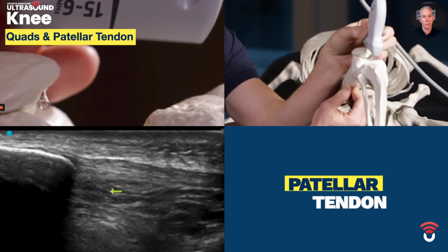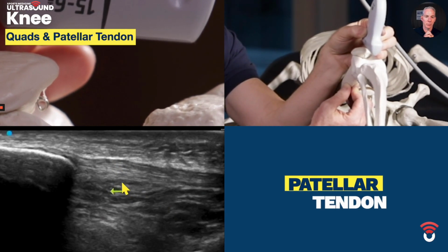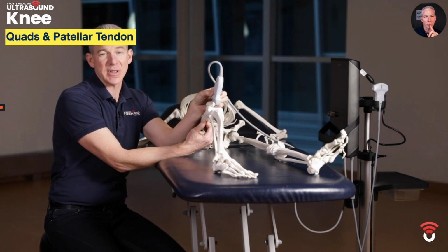Of course, we also see the Hoffa's fat pad. It's the large area in the center of the screen. So that's how we scan for the suprapatellar recess of the knee, which is where we do a knee joint injection, the quadriceps tendon, and the patellar tendon.